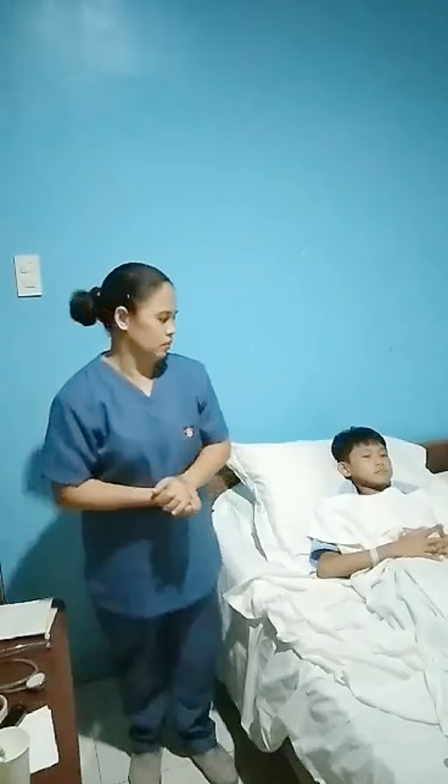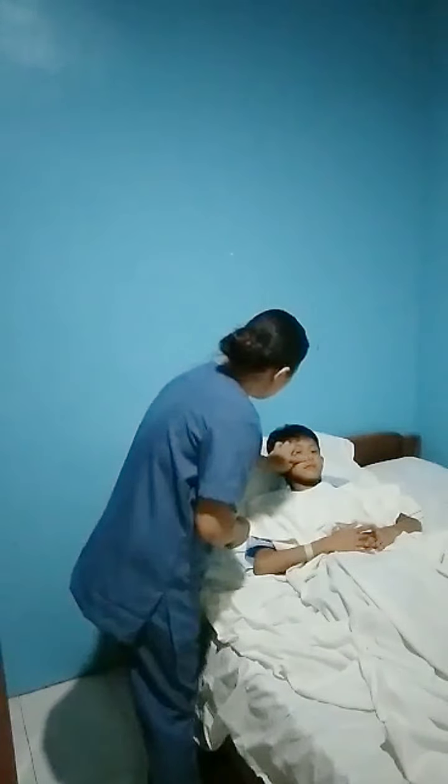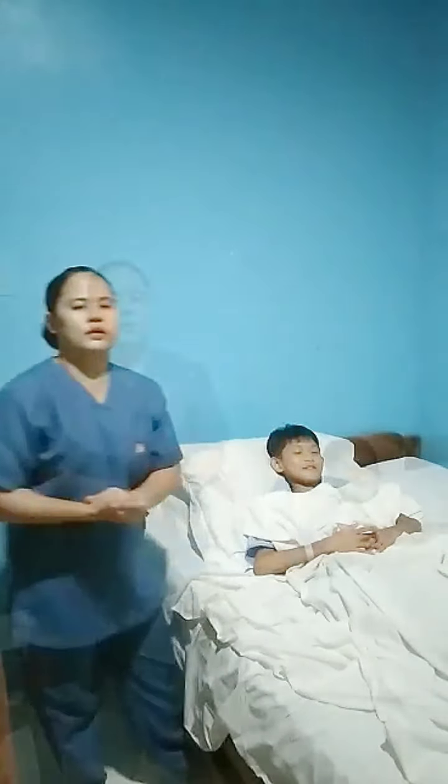Alright, good. Or another way is to let the patient blow air from the nose. So first we have to cover the first side of the nose and then let the patient blow. And then check the other side as well. So Ryan, I'm going to cover your nose. Please blow air. Alright, how about the other one? Okay, good. Well, this helps us to choose which side of the nose to insert the tube.